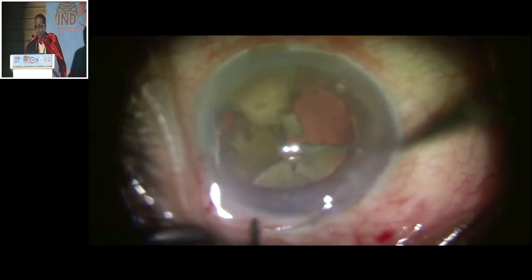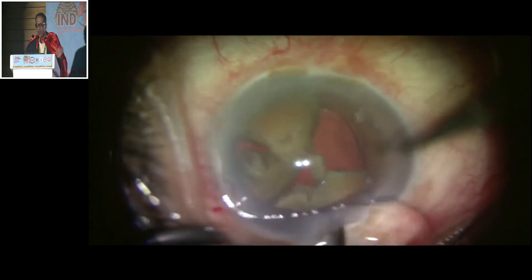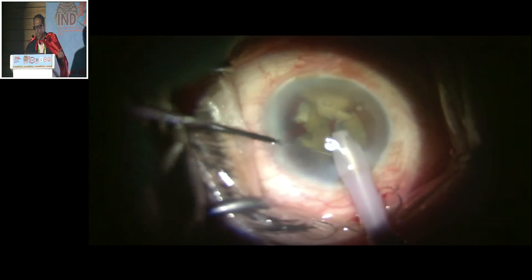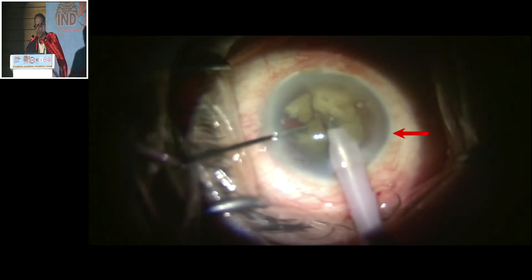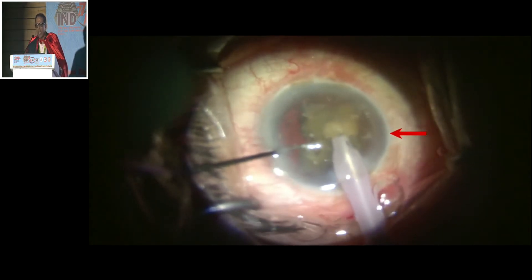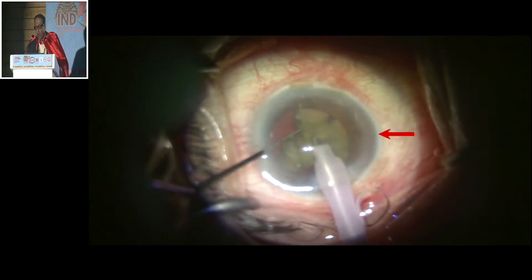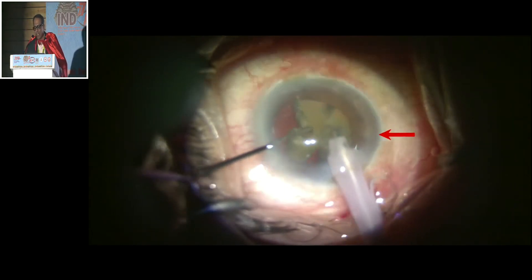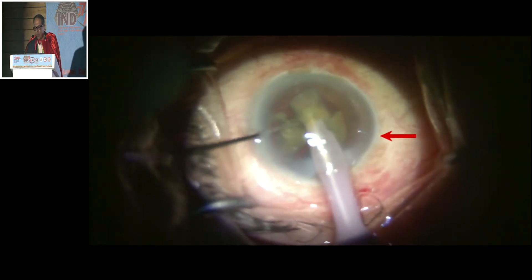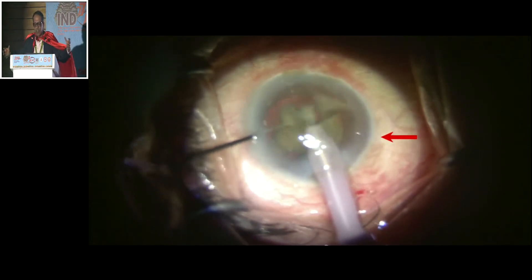What about the anterior-posterior support? Mark my words — the nucleus pieces are going to give the anterior-posterior support. I place it there, using the nucleus piece as a scaffold for the first time to avoid zonular dehiscence in that area. Now this nuclear piece is giving anterior-posterior support and the CTR is giving the horizontal support.